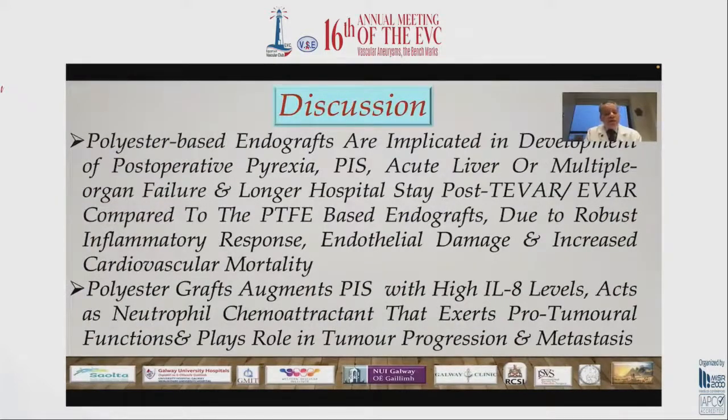We know from our clinical experience that polyester-based endografts are implicated in the development of post-operative pyrexia, which we call post-implantation syndrome. All of you know about it, and everybody said, oh, there's no problem with it. No, wait. This PIS, or post-implantation syndrome, creates acute liver or multi-organ failure and longer hospital stay post-EVAR and TEVAR compared to the PTFE-based endograft. So you put a polyester-based versus a PTFE.